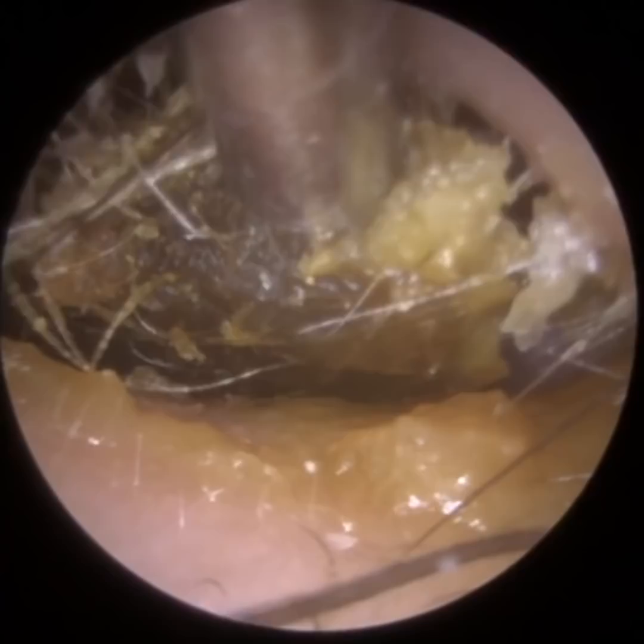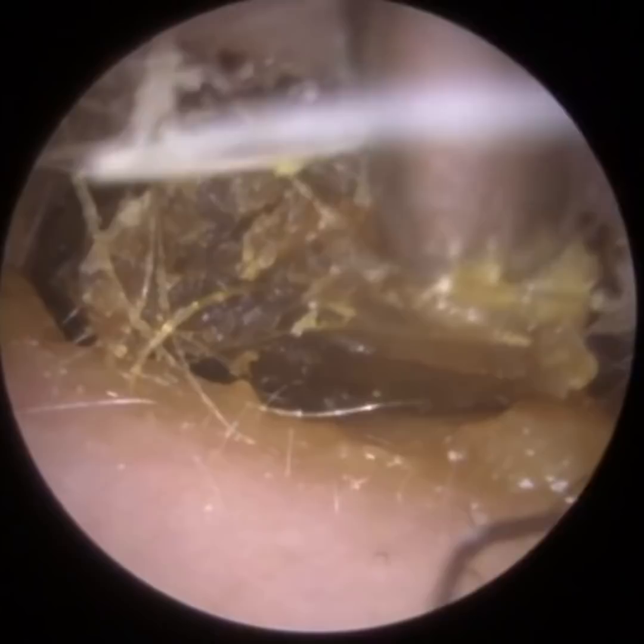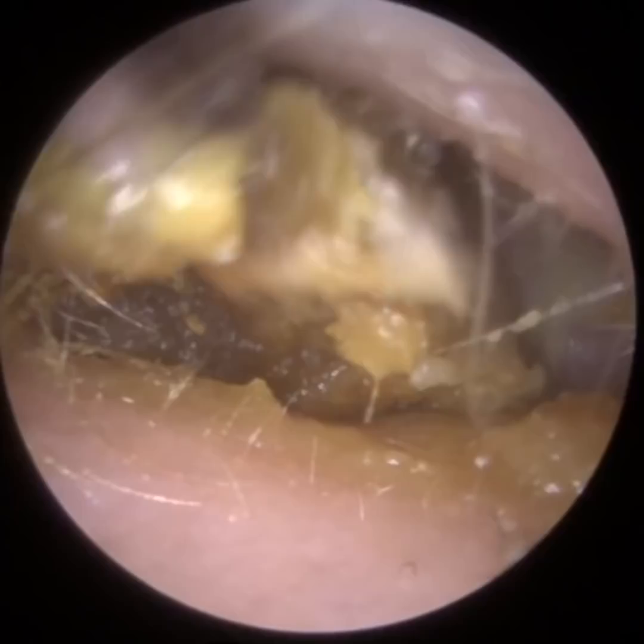This plug is strongly attached to the base of the ear canal. I'm using a standard Zoellner suction probe to wriggle it, trying to detach it from the floor of the ear canal, and I do eventually remove this in a large plug.